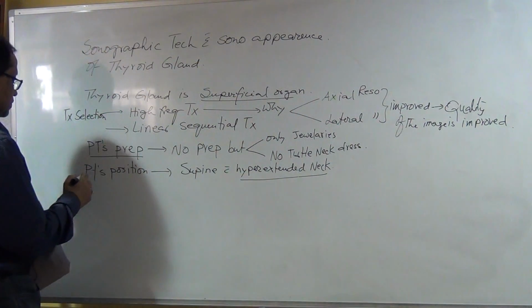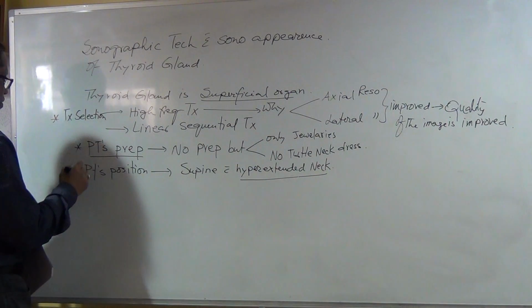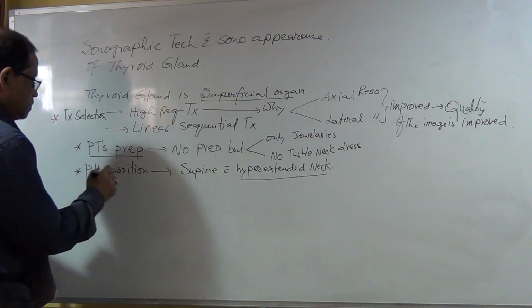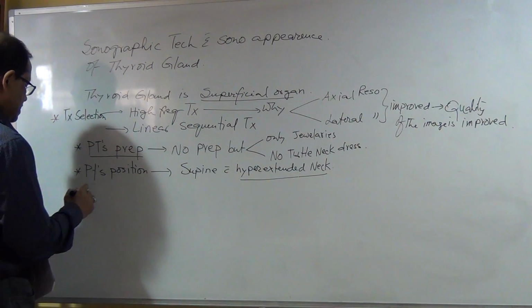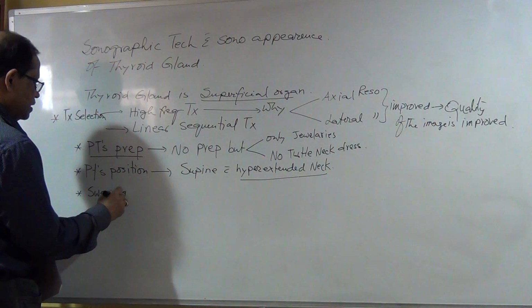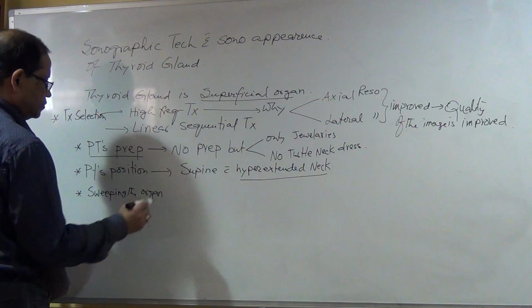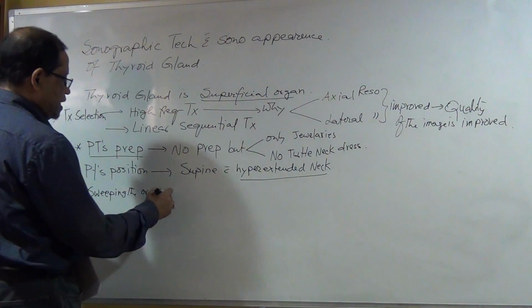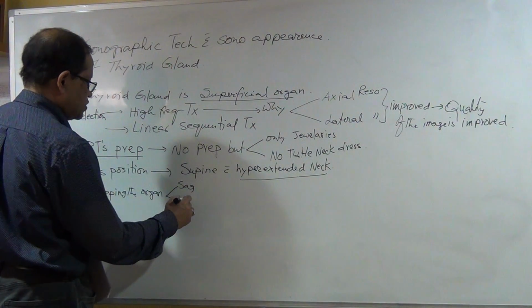Okay, so this is the patient position, and then swiping the organ, swiping in both sagittal view and transverse view.